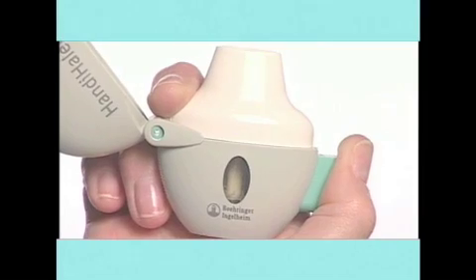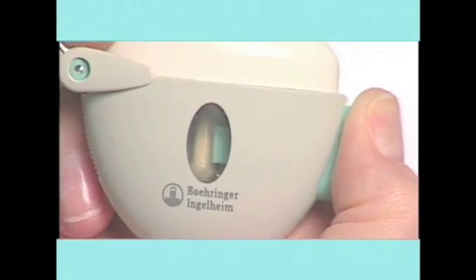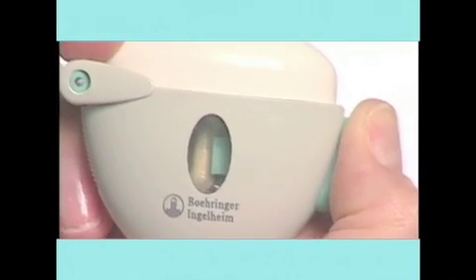Hold the Handihaler with the mouthpiece upwards. Press the piercing button once and release. This puts holes in the capsule. Now the medication is ready to use.